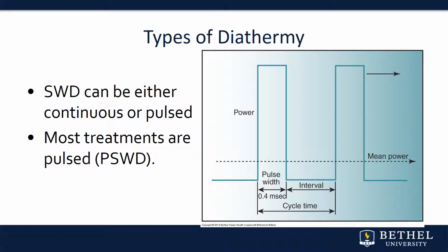Shortwave diathermy can be either continuous or it can be pulsed. Now, most treatments are with pulsed wave diathermy because the heat doesn't accumulate and become so intense. So I don't know that I've even ever seen a continuous shortwave diathermy unit.